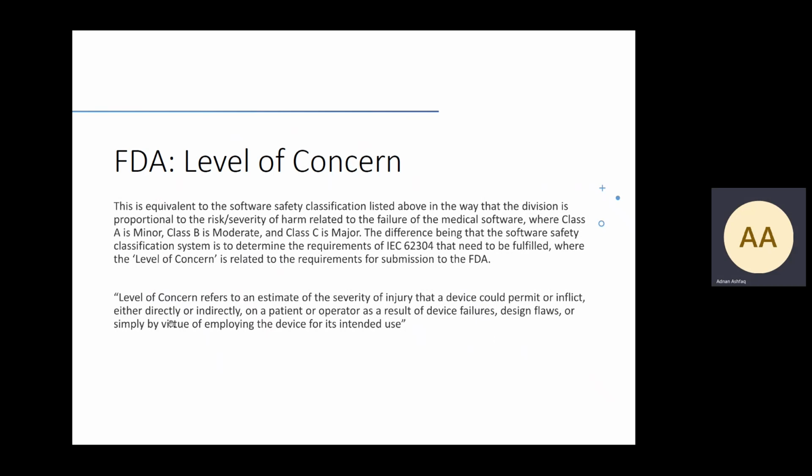And the definition here is level of concern refers to an estimate of the severity of injury that a device could permit or inflict either directly or indirectly on a patient or operator as a result of device failures, design flaws, or simply by virtue of employing the device for its intended use.